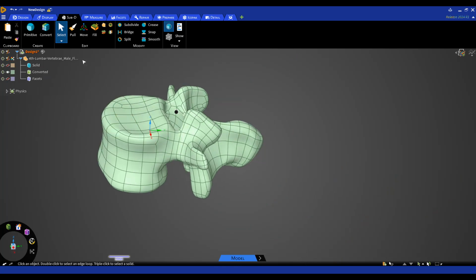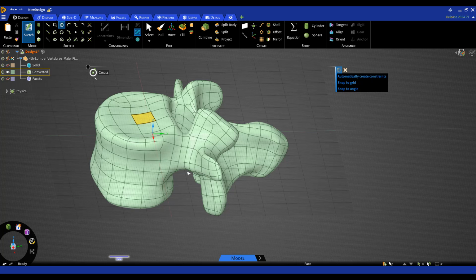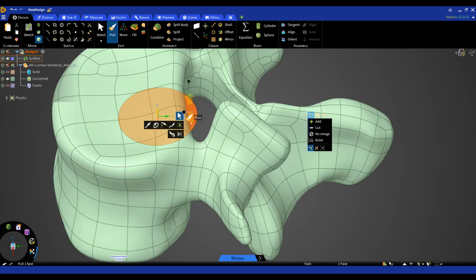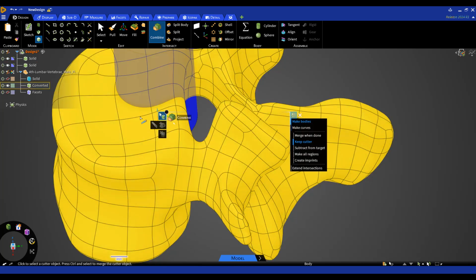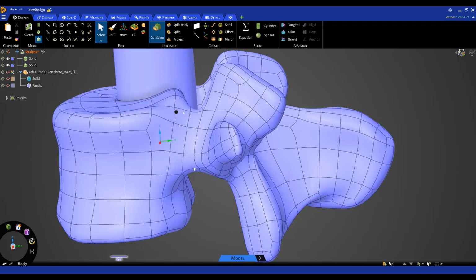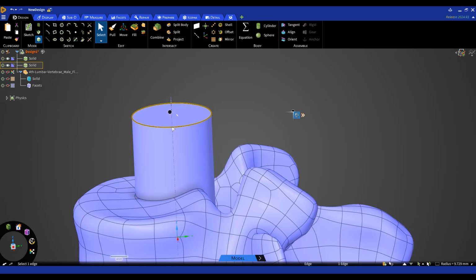So if I wanted to draw something here, let's say we sketch on this, I draw a cylinder on this surface. And pull on it, and we can, for example, combine. So operate this just as if we're doing a regular CAD model. Okay, combine it together. Now I have a single geometry that looks like this, and I can make changes to it by adding fillets.